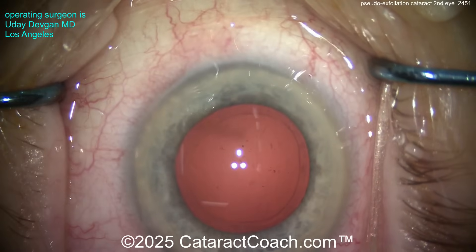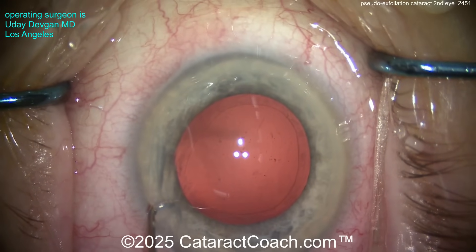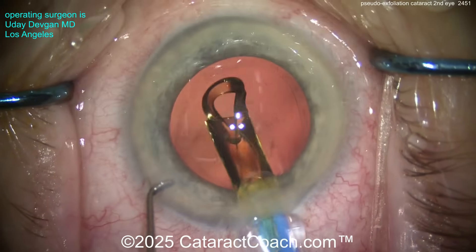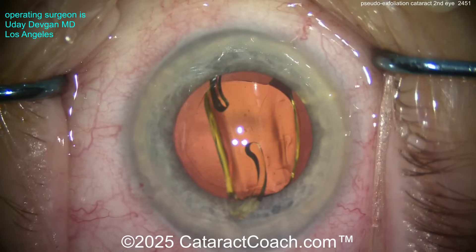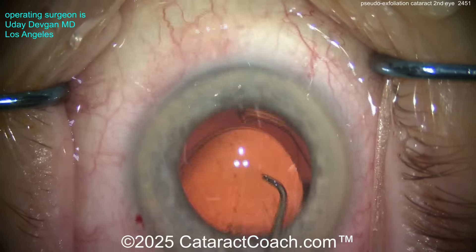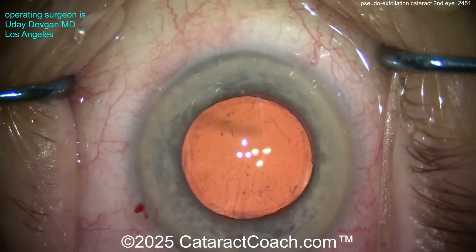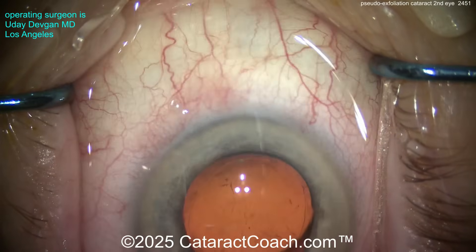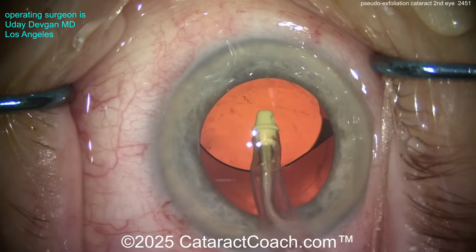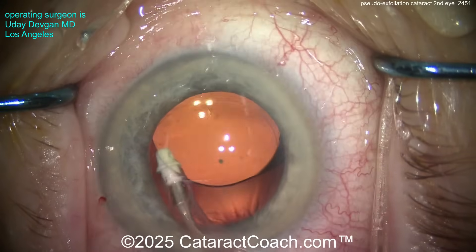Let's put the lens in the bag and forego doing a CTR for now. We'll watch the patient closely — probably the most important thing I can do is watch the patient closely at the post-op visits. At the three-month, six, or twelve-month mark, seeing the patient and looking for any evidence of capsular phimosis of the anterior rim starting. And if so, why not just use that YAG laser sitting right there in your clinic and do relaxing cuts at 12, 3, 6, and 9 o'clock around the anterior capsule rim. There's the rhexis — you can see the six-millimeter optic. That rhexis looks spot on, about five and a half millimeters. Removing all the viscoelastic from the capsule bag. In this case, we're going to leave it — I think the patient's going to have a nice result, and we'll watch them in the post-op period.